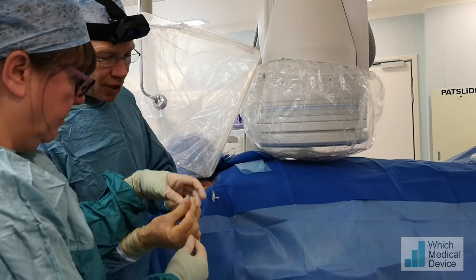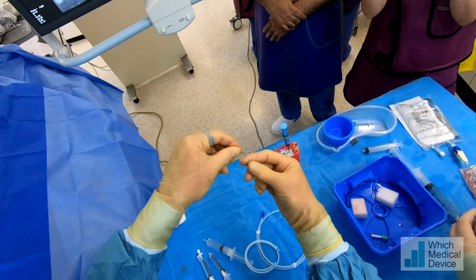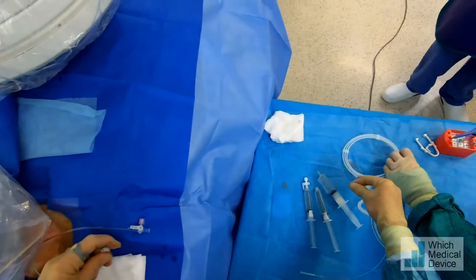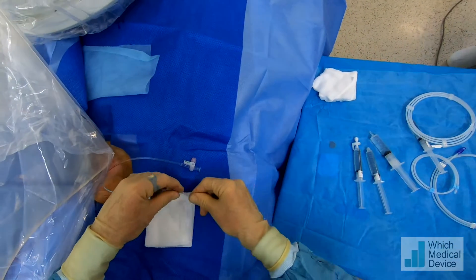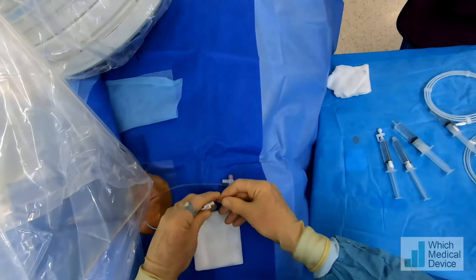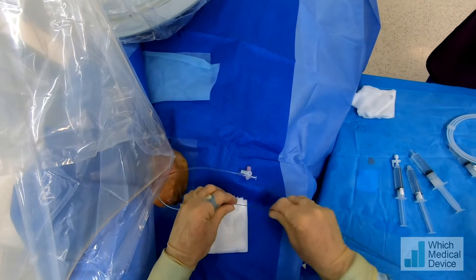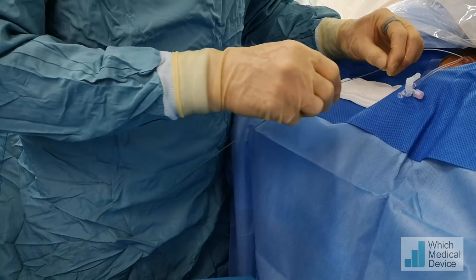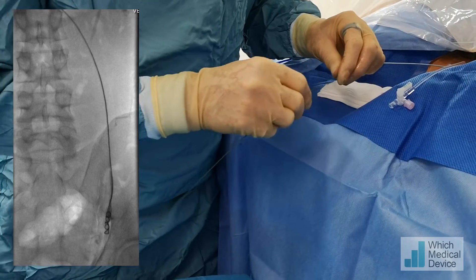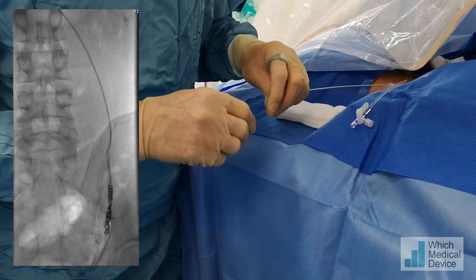This is the Spirali coil, which comes on a holder. You need to slide the coil down on its holder and then take the end off, which is sometimes a little bit stiff. I'm then going to advance it into the catheter, take the holder off, take the pusher out, and now push it with the straight end of this double-ended guide wire — they're very radio-opaque and you'll see it come down the catheter very readily. You can see it there. I'm just going to tap the coil, make it coil up, and I'm coming back with my catheter as I'm coiling the coil.